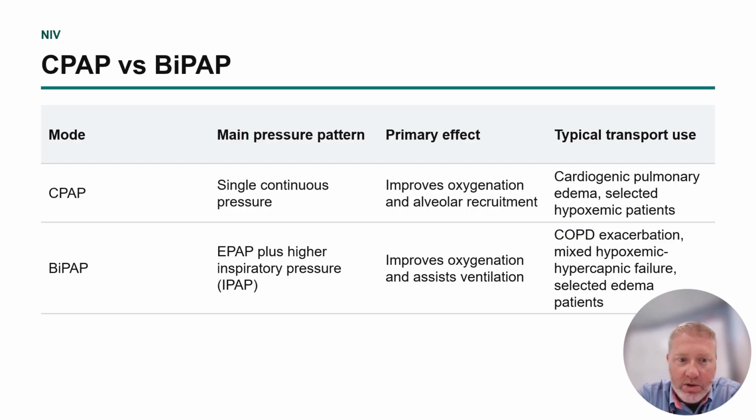So people with airway obstruction when they sleep. BiPAP, on the other hand, has two pressures.